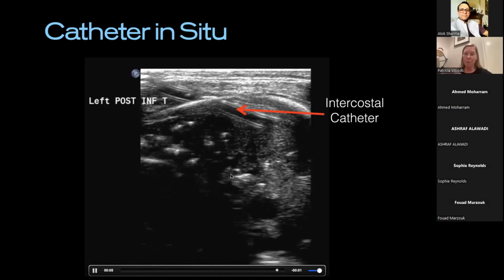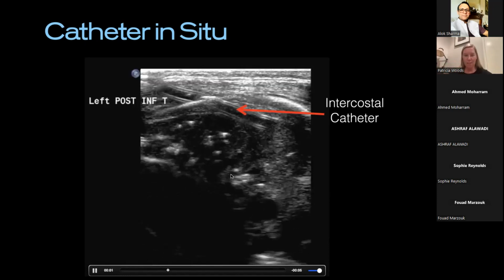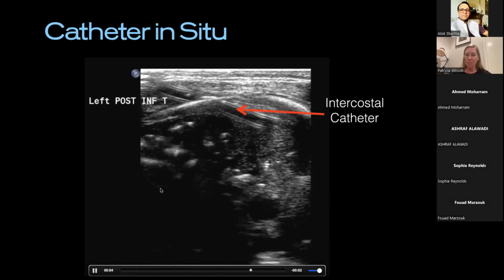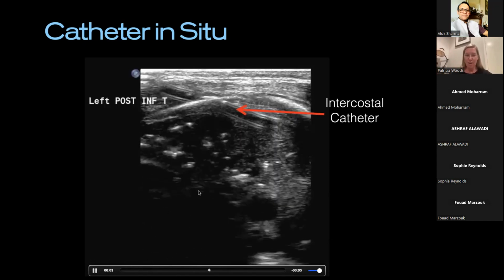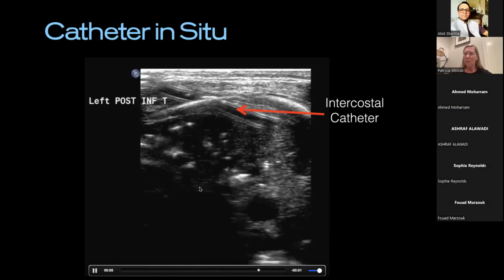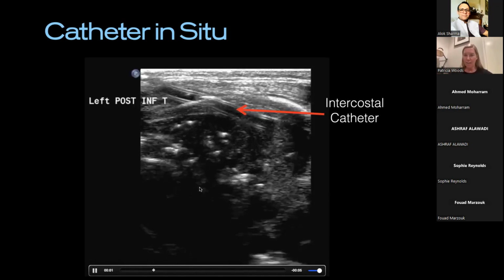So you've lost the pleural line, you've got air bronchograms in it. I'm actually getting lung pulse. What you've got here is the sort of cardiac structures that are really dark, and you just get this beat and bob. It's transmission of cardiac activity.